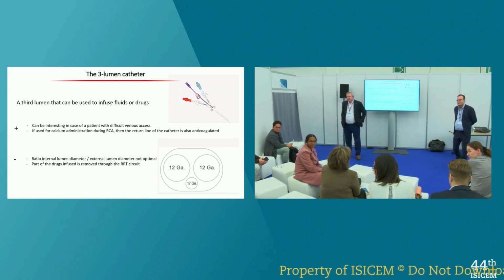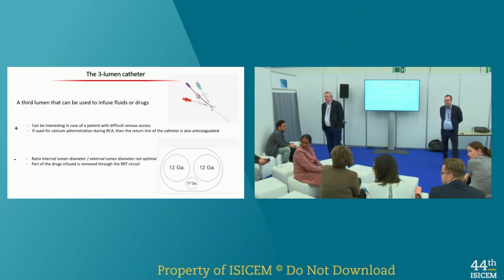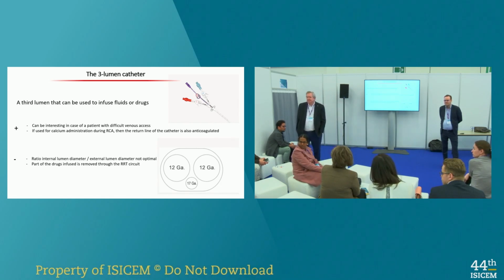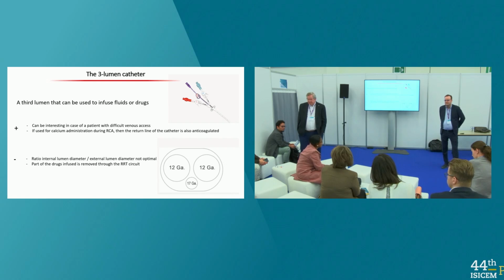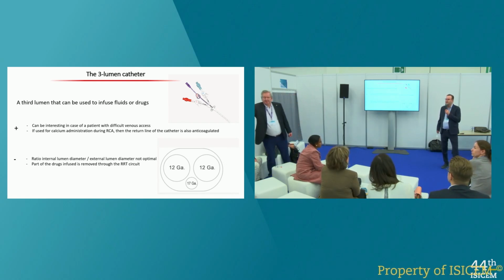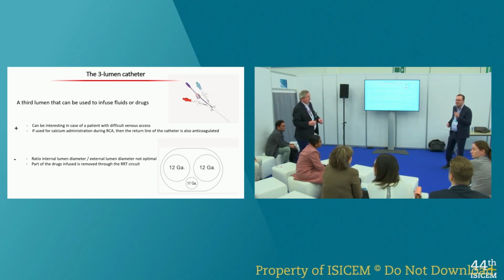I'm sure we all take care of very sick patients who have all sorts of vascular issues. So it's not abnormal that we can't use the femoral line and we already have something in the right IJ. If someone has a bad vascular path and they have a large EJ instead of an IJ, is that something that you would support using instead of using the subclavian? The question is, can you put the central line and the dialysis catheter in the same line, right?